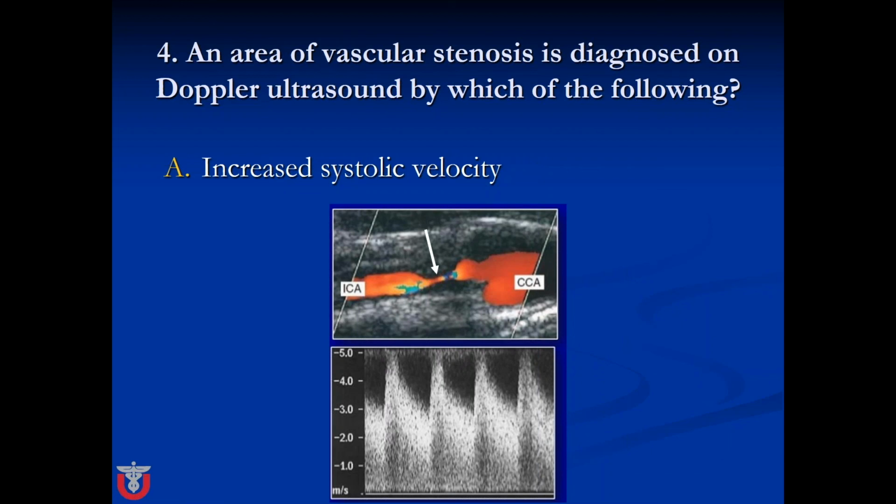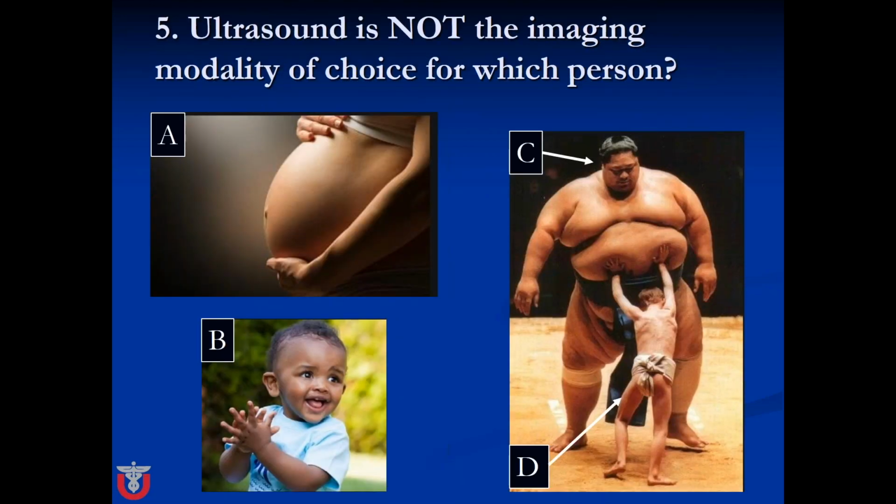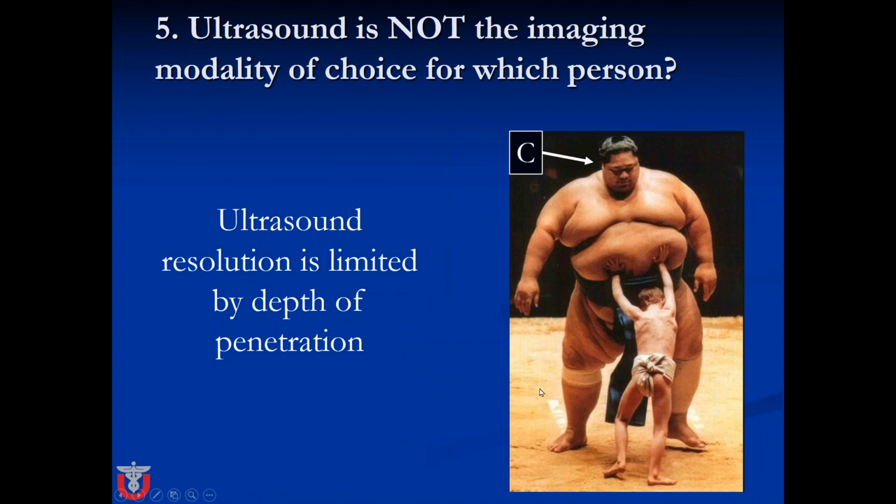And then finally, who should not be scanned with ultrasound? Well, it's perfect for pregnant women, children, small adults, but the answer is C. Ultrasound resolution is limited by the depth of penetration. We start to lose our ultrasound strength as we go down.